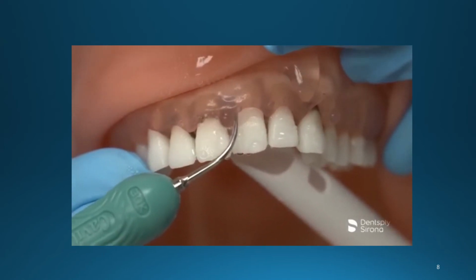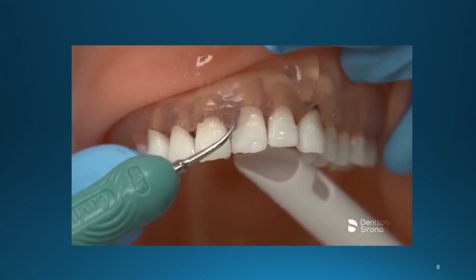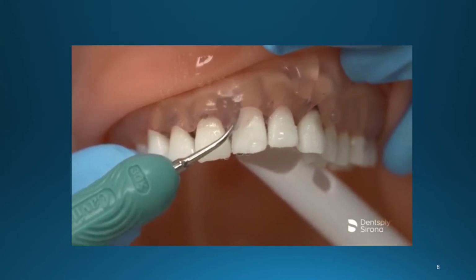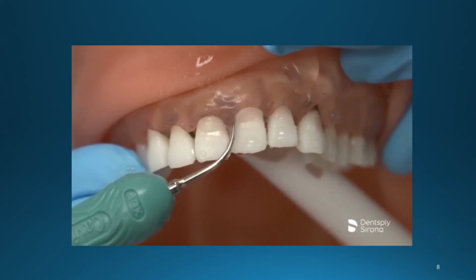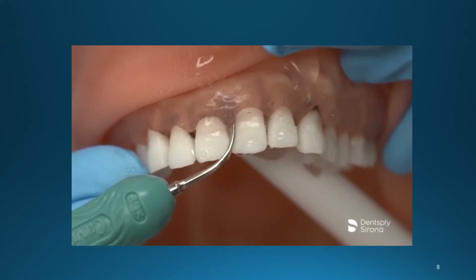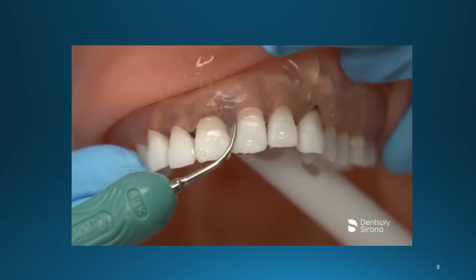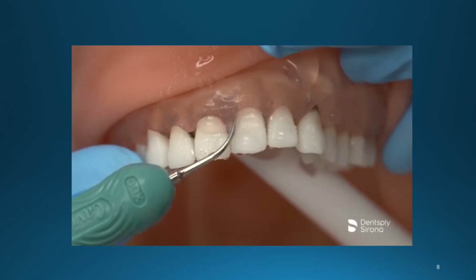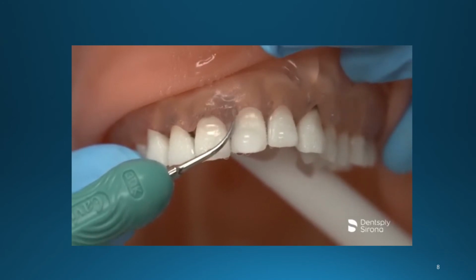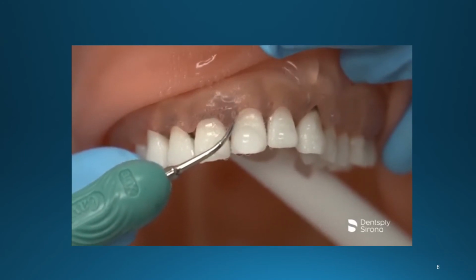Following the vertical orientation, the clinician will adapt in a transverse approach under the contact areas for complete debridement interproximally. Knowledge of each area of anatomy is essential for successful removal of calculus. A thorough periodontal charting and accompanying radiographs are also essential tools for effective ultrasonic instrumentation.